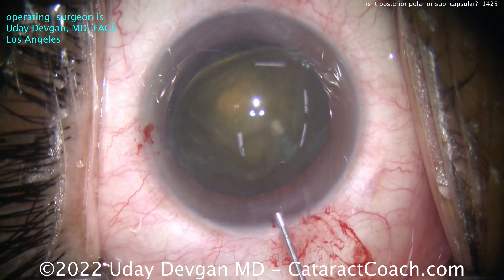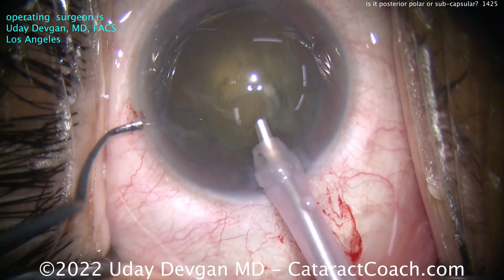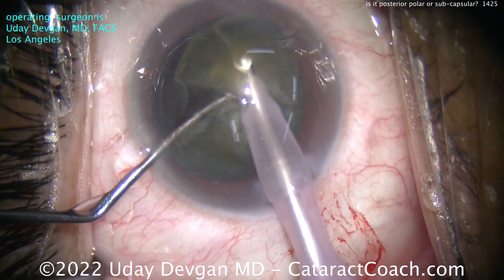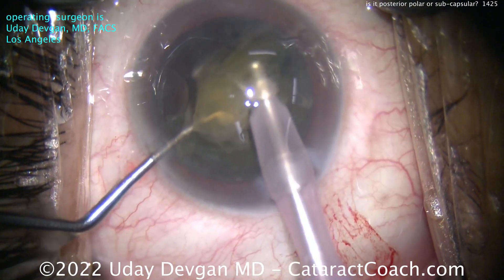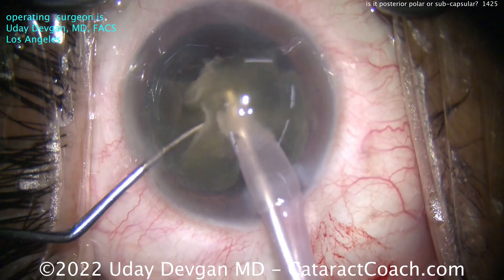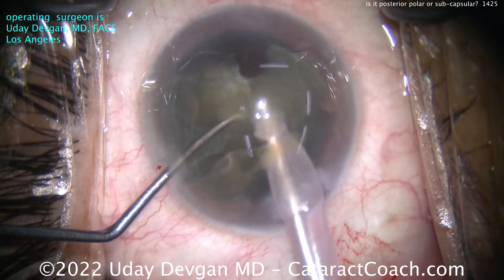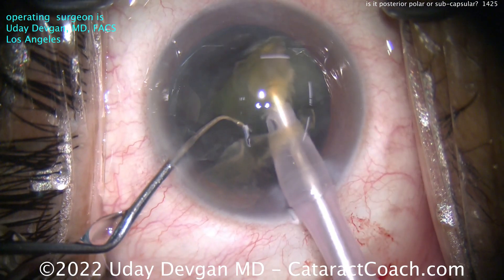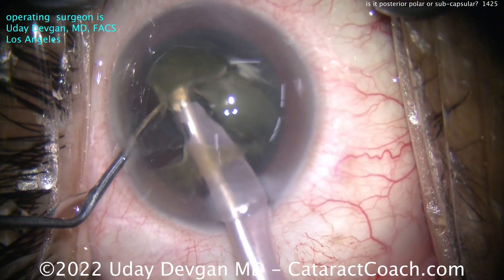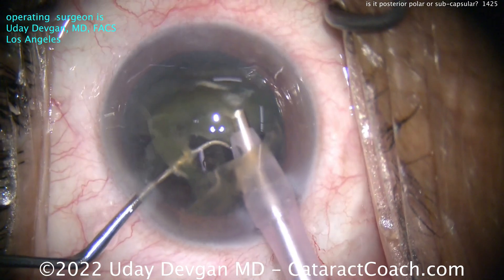So did I make the right choice? Time's going to tell. I got the nucleus partially out of the capsule bag — we did hydrodissection. As you know, if it was a true posterior polar I wouldn't want to do that; I'd be cautious. But let's chop the nucleus — it's partially out of the bag. There are two halves. Let's wolf down these two halves and make short work of this. I'm a little nervous: I'm just going to focus on removing the nuclear pieces right now.